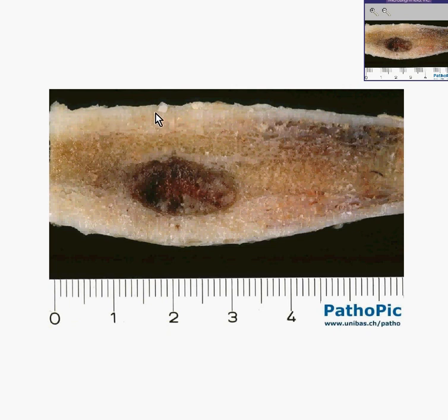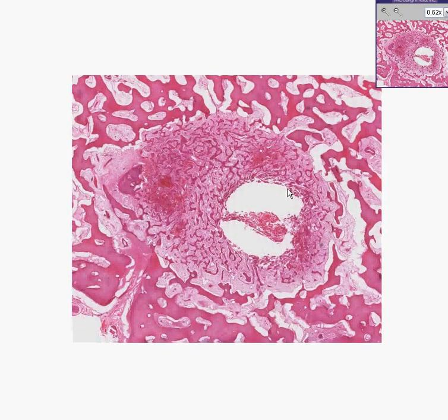Note that the bone itself is a little bit widened in this area due to the fact that there appears to be, in fact, more than sort of, a tumor within this bone. This tumor is called an osteoid osteoma. It is a tumor of generally teenagers and young adults. It occurs more likely in the lower extremities.